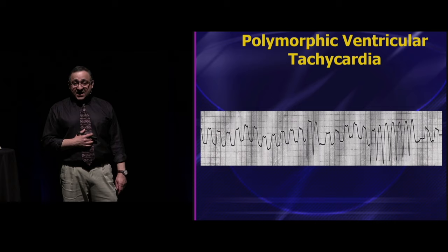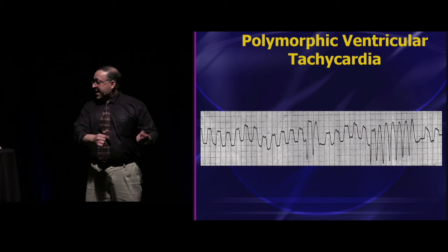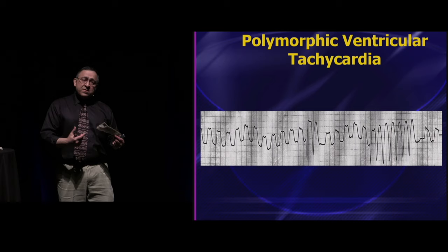They're going to be unstable. Almost certainly they'll be unstable, so you're going to shock them. So you shock them out of it. Now they're back to sinus rhythm, all right? Hooray. So now you get a new 12 lead on the patient during sinus rhythm, and you look at the 12 lead, and it's a normal QT. So you can say, oh, that is a normal QT, so that must have been that generic run-of-the-mill polymorphic VTAC.